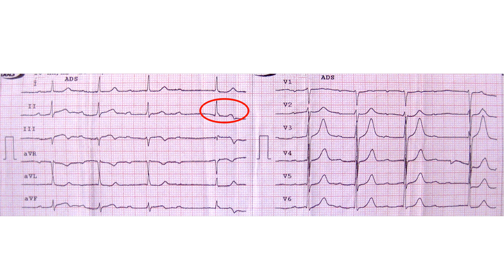As its morphology is similar to those of the previous QRS complexes, this is an escape junctional contraction. The fourth P wave is blocked.